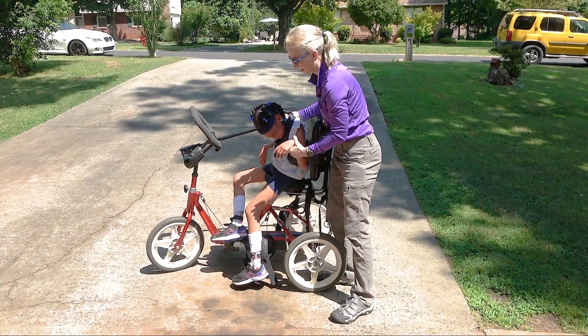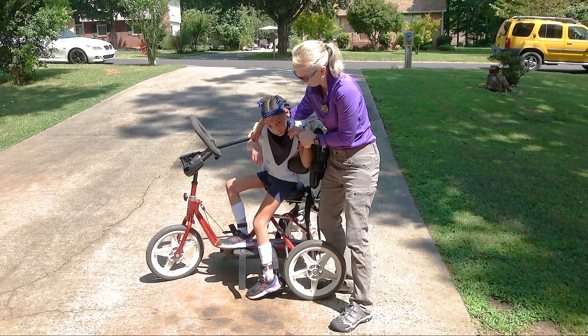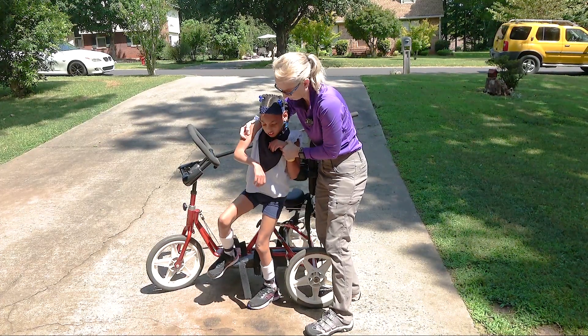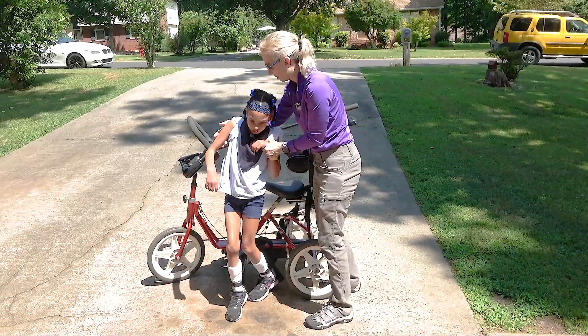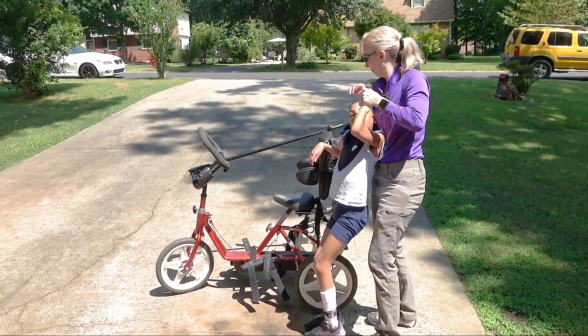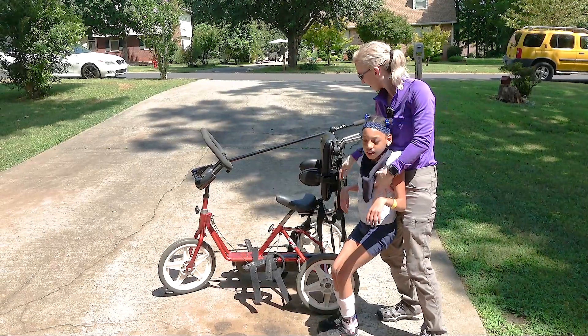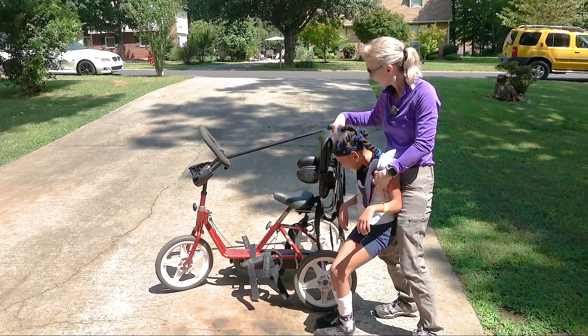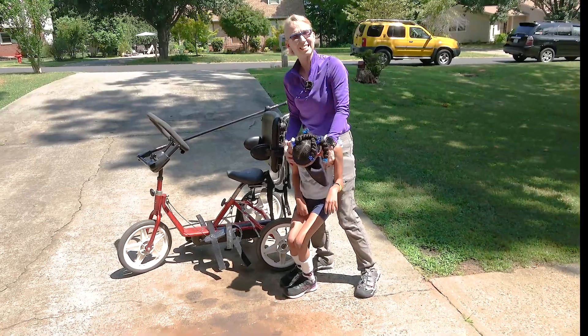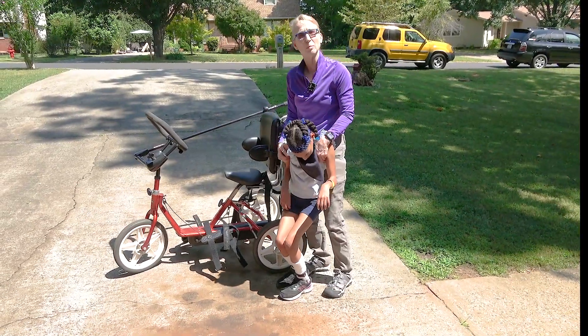Ready, Alexis? Show me how you can get down. There you go. The other adjustments on this tricycle are the backrest — with these screws back here it goes up and down. And with this, you can raise and lower the seat just to make it fit a little bit better.